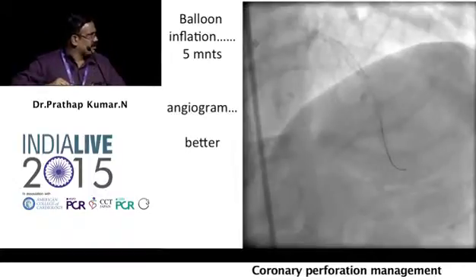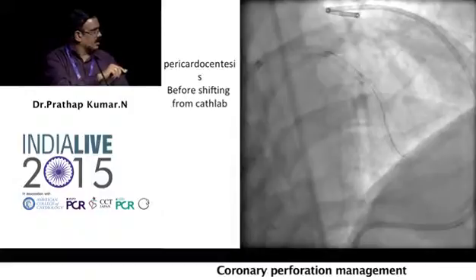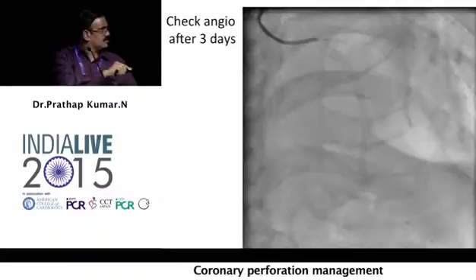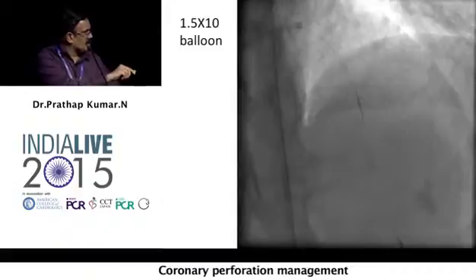Balloon inflation for 5 minutes, the angiogram became better, the patient stabilized, but with a pigtail in the pericardium. Check angio after 3 days like this. This is another case. I'm showing only complications, but you may think that I produce only complications.